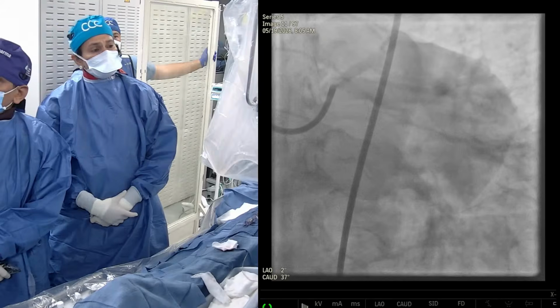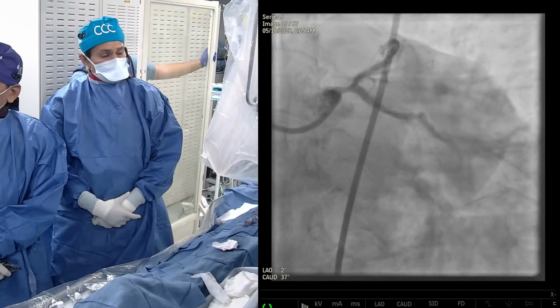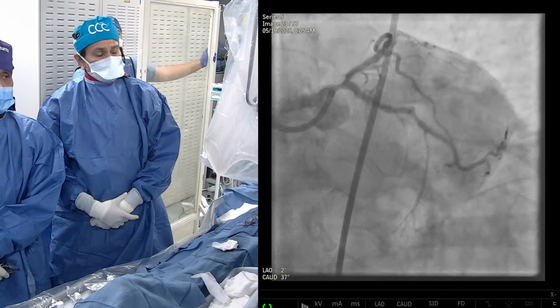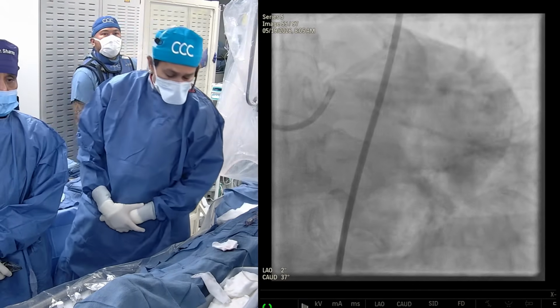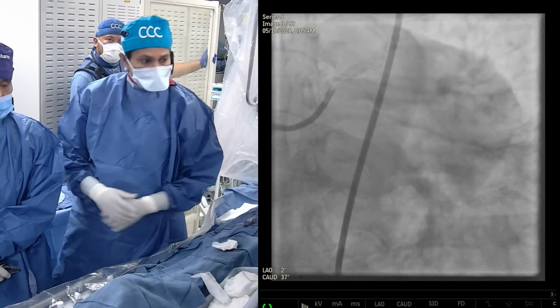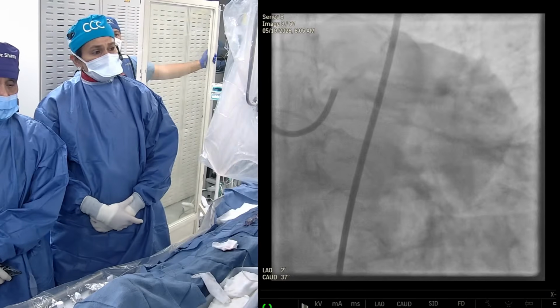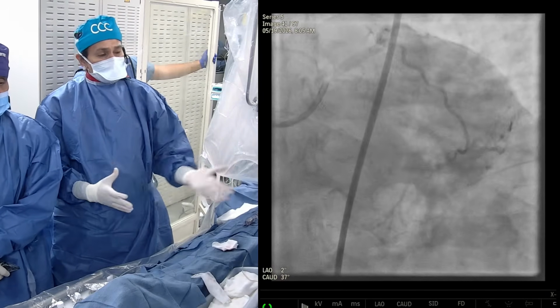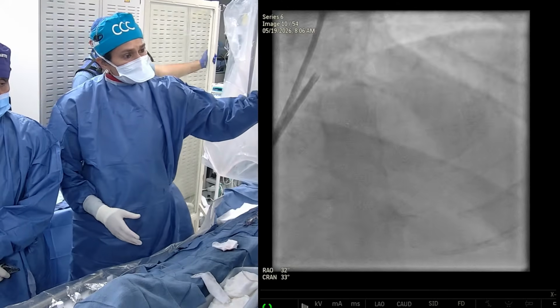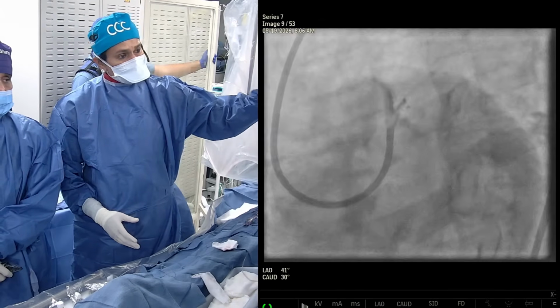With a short left main, it's okay to go with the FCL. The FL guide does not give you a lot of support at all. We prefer the FL guide if there is ostial left main disease, so that placing of the stent and all that is much better. So we took the FCL guide. Normally you see us with the VL guide. So this is a C curve. We have to make sure we'll be able to get into the LAD, which is at this point here.